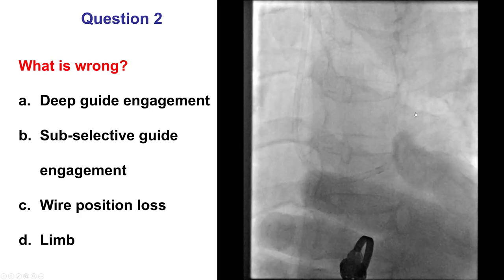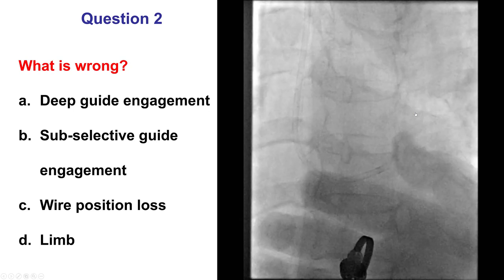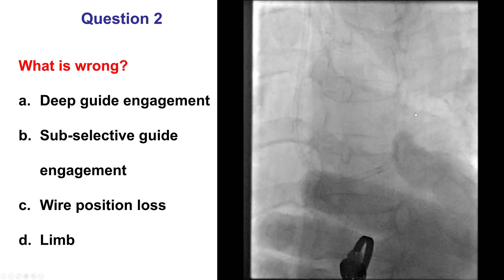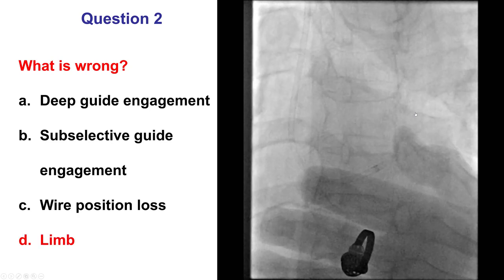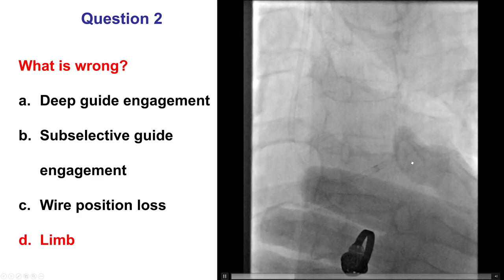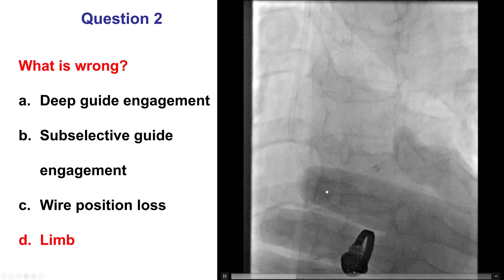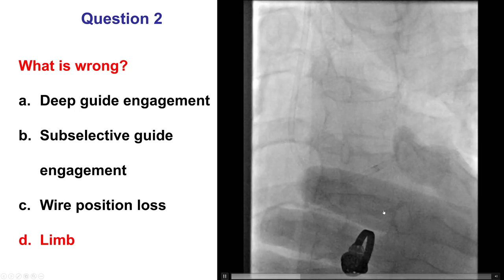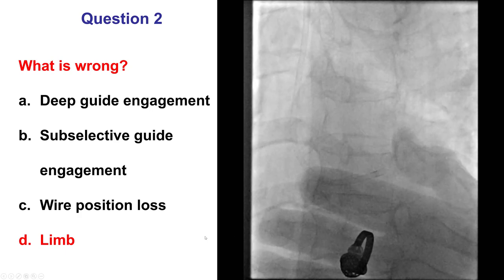Second question: what is wrong in this image? The options are deep guide engagement, subselective guide, losing wire position, or a limb in the field. The answer is the limb — what we're seeing is the patient's hand in the picture. We don't want anything in the field, not only because it interferes with image quality, but also because it increases radiation dose for both the patient and the operator. Both patient and operator limbs need to be outside the x-ray field.